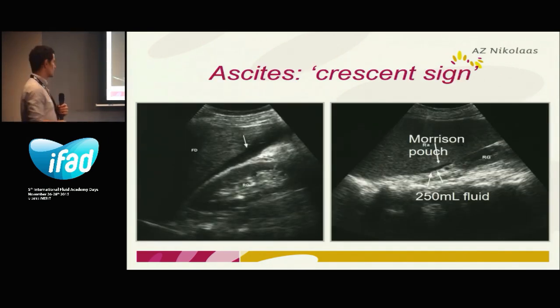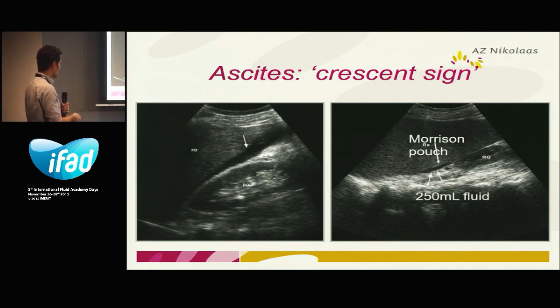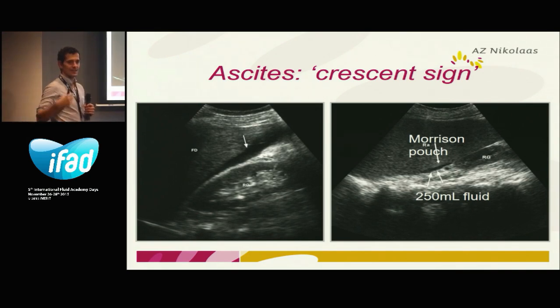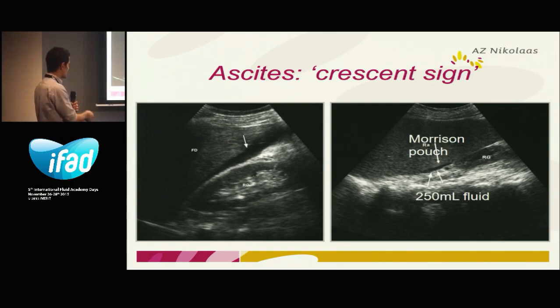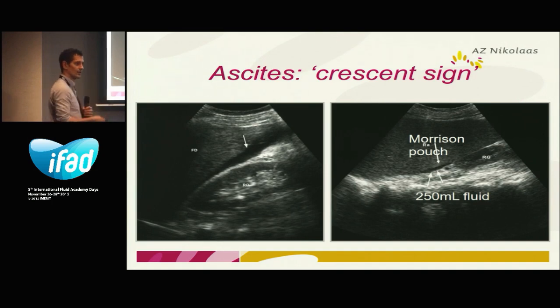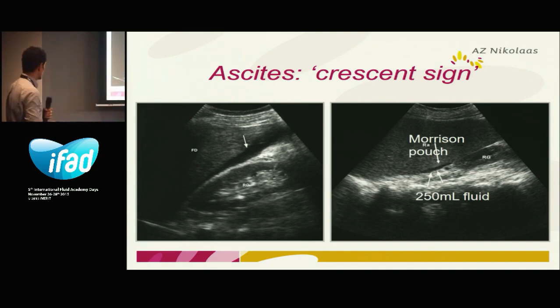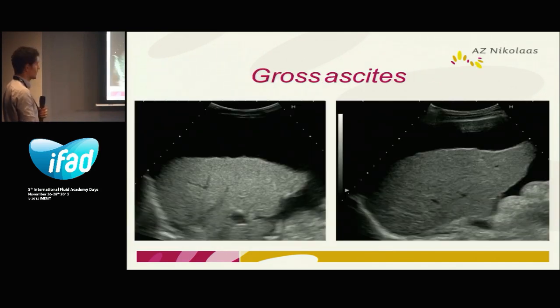Then ascites — very important. If there is only a small amount of ascites, you will appreciate it in the Morrison pouch, between the right kidney and the liver. You will see the crescent sign — this is only 250 milliliters of fluid. When there is a little ascites you see it here. As it increases, you see the liver swimming in a black pool — this is already a little more ascites, and this is a lot of ascites.